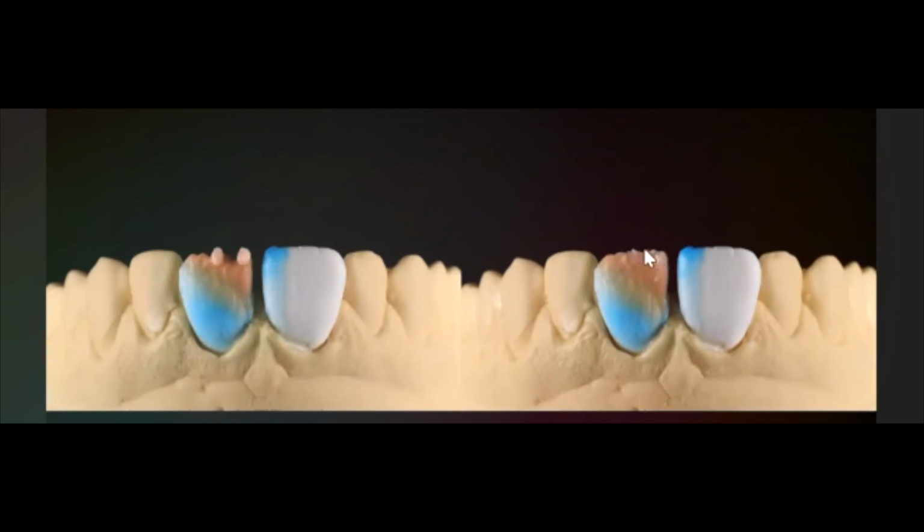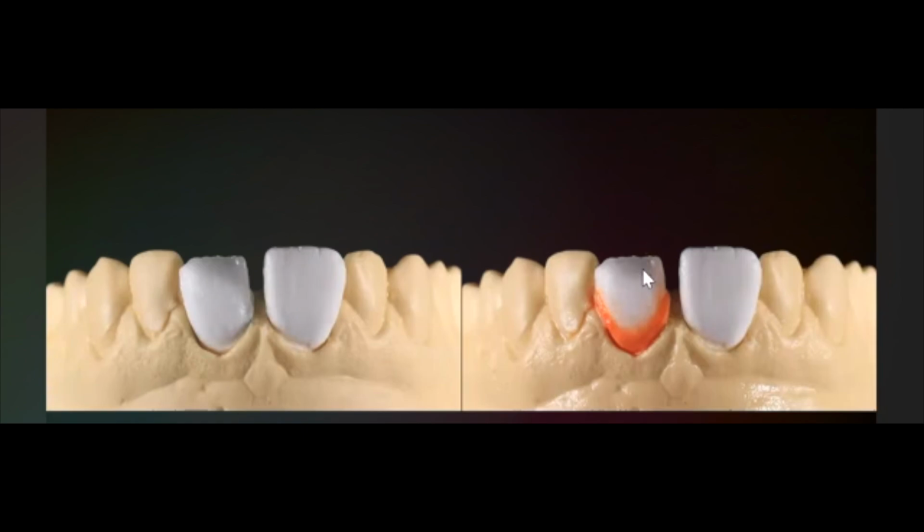It was opalescent opacious body. So I mixed like 50-50 opacious body with opal in order to make the last part of the opacious body a little bit more opalescent. We bake it, you can see the difference here. We have the opacity, and then the last 1.5 millimeter is more opalescence and more translucency.